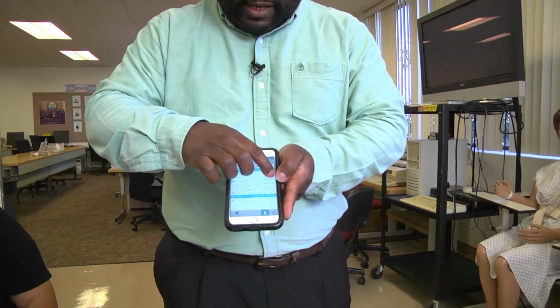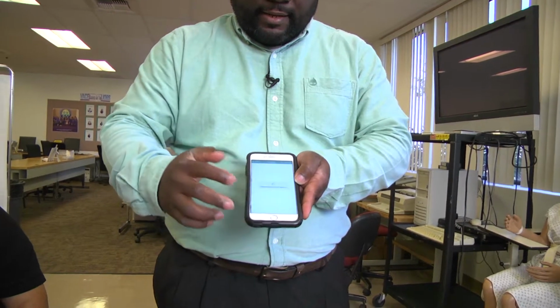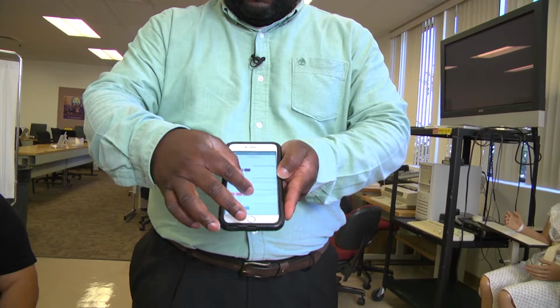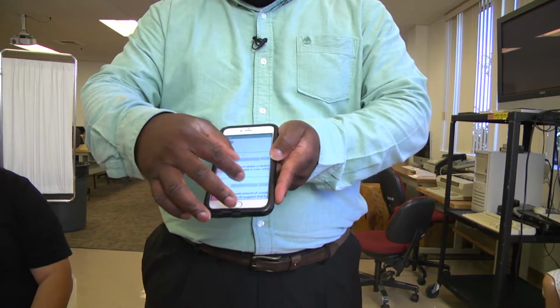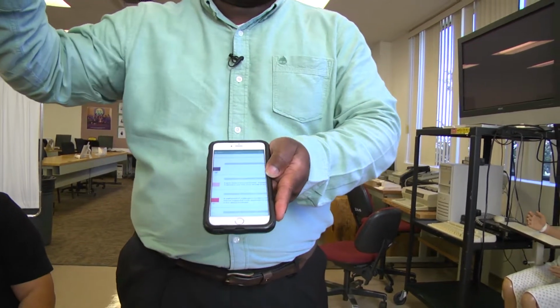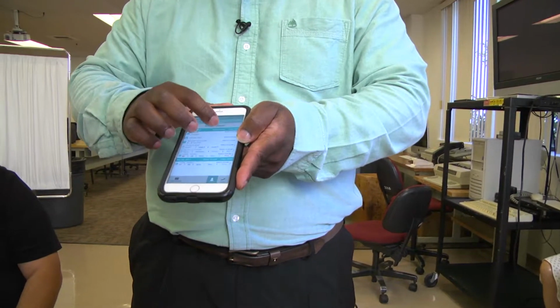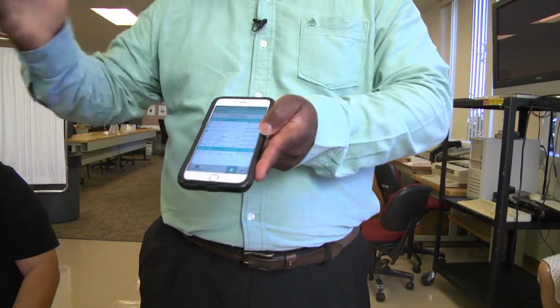So I can go into urinalysis, which is what I selected, and then the PDF will give the selection and what that means for that particular chemical in the urine. I can then print a PDF, or send an email of the whole composite of all the exams that we just took to a medical professional, or I can view a PDF of it.